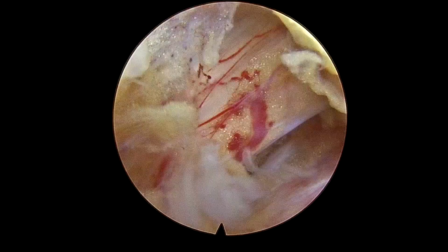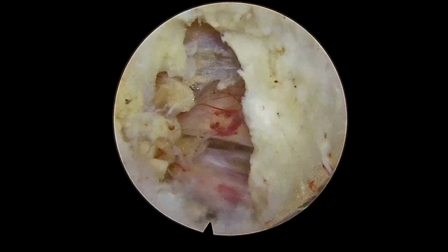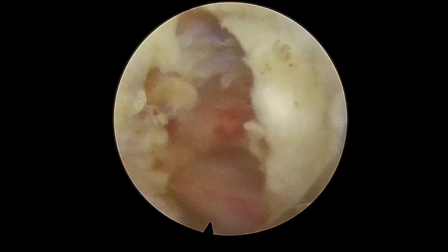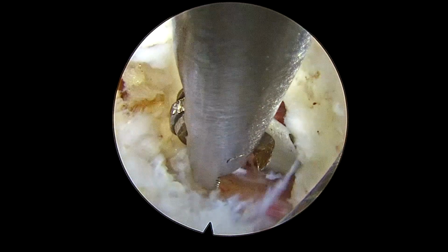Now you can see the overview here. The root is completely decompressed. You can see this is the flavum window which we have created. It is not more than 6 to 8 millimeters of window which we have created for the entire surgery. This was the flavum incision we used. It is not more than around 6 to 8 millimeters of the flavum which we have removed to get access to the epidural space.